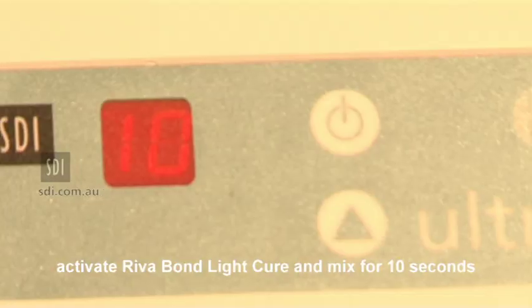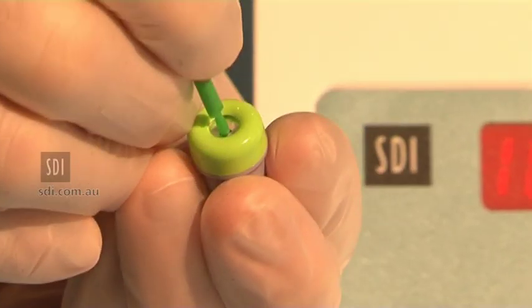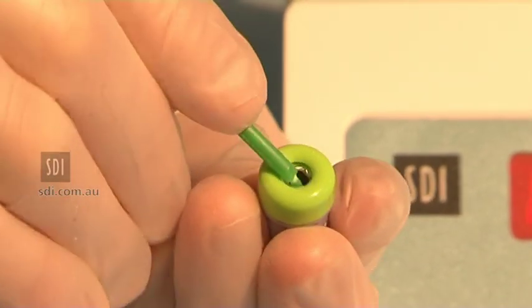Activate the Reva Bond LC capsule and mix for 10 seconds. Pierce the foil cover of the Reva Bond LC reservoir using the supplied brush. Rotate the brush to push the foil to the sides of the reservoir.